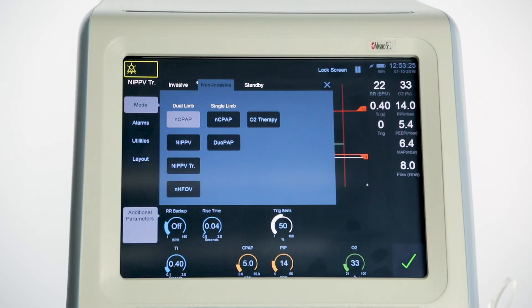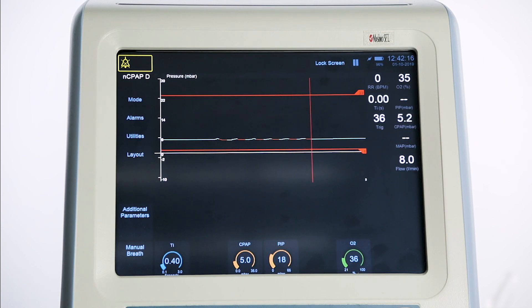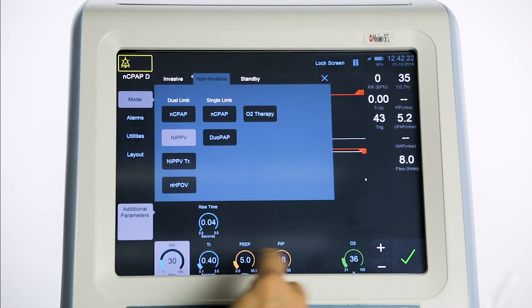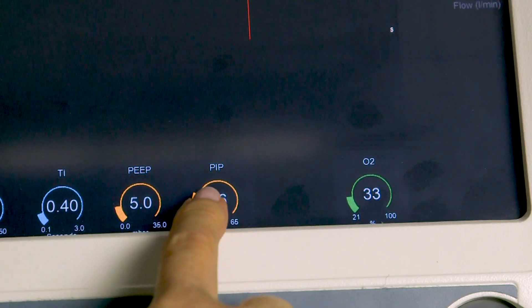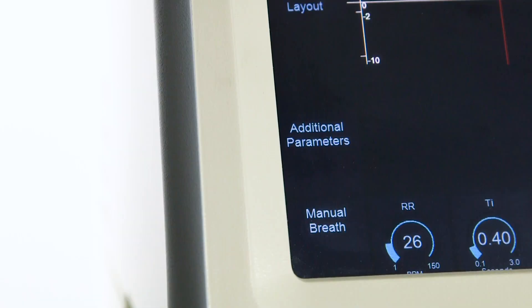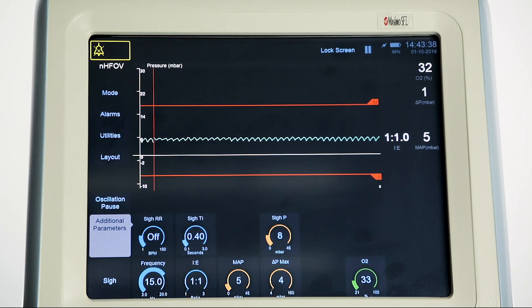To use dual limb non-invasive ventilation on the SLE6000 we recommend using the SLE MiniFlow. When setting up any new mode, all parameters can be selected and changed using the plus and minus buttons before commencing ventilation. Once all the changes are completed, press tick to confirm. Ventilation will then start. During operation, any parameter may be individually selected, changed and then confirmed. The additional parameters button can be selected at any time in any mode, the contents changing depending upon the selected mode and the relevant options available.